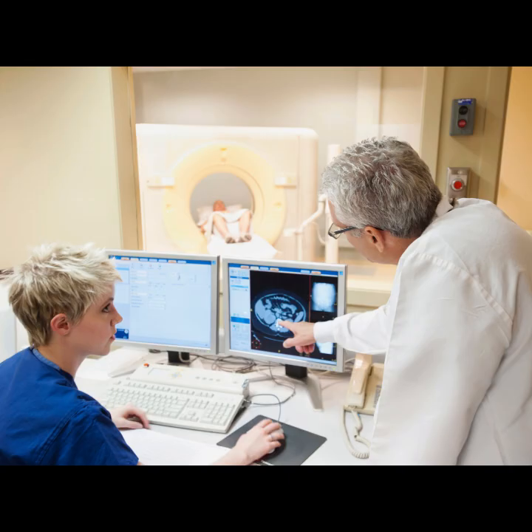But that control runs straight into two pretty immutable limits: the inherent short lifespan of the MR signal, what we often call the tyranny of time, and the physical limitations of the gradient hardware, specifically how fast we can turn the gradients on and off, the slew rate. So this brings us to our central disagreement today. To get fast, high-quality images, should MRI acquisitions stick with these highly structured, predictable, fixed classical trajectories, or should we be moving toward dynamically learned and optimized trajectories?